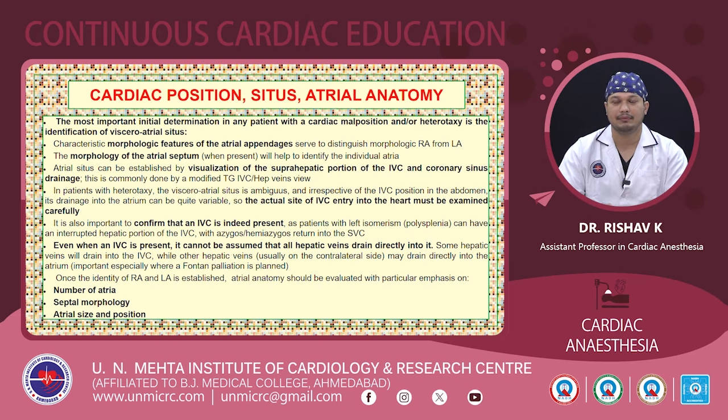But that is possible only for patients with normal anatomy. Here we cannot assume anything. We have to look at each of the chambers, we have to look at each of the vessels, and most importantly, we have to look at the point of connection of these great vessels to the cardiac chambers.